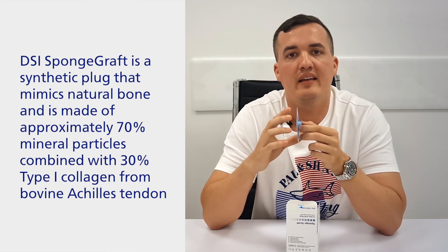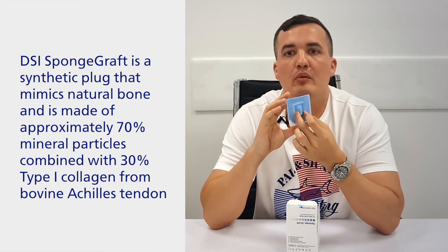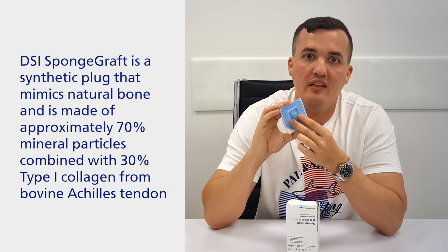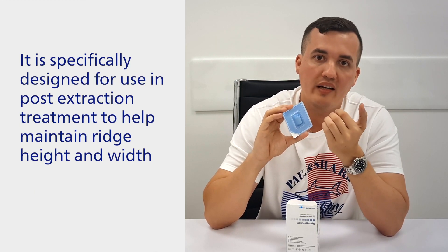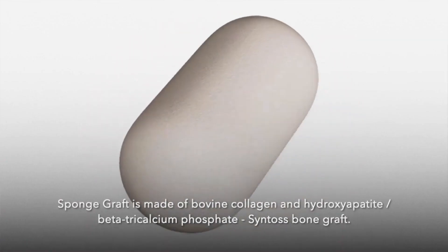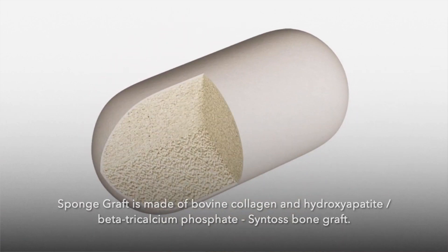For an all-in-one collagen plug and regenerative dental material, consider sponge graft instead. When it was developed, the core idea was to use the outer collagen — this bovine Achilles tendon collagen matrix — as the envelope for bioactive resorbable calcium phosphate particles, and create a structure that mimics both the organic and inorganic properties of human bone.